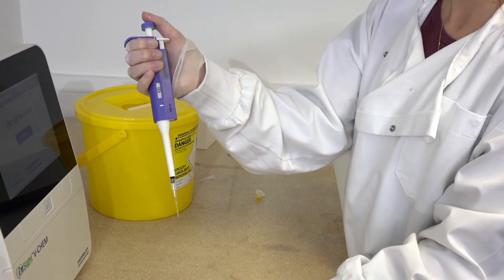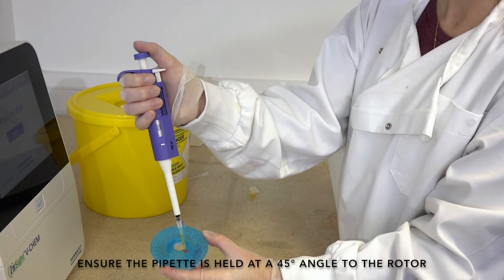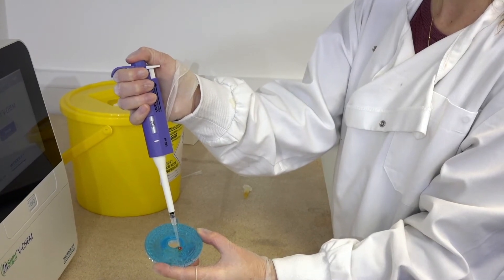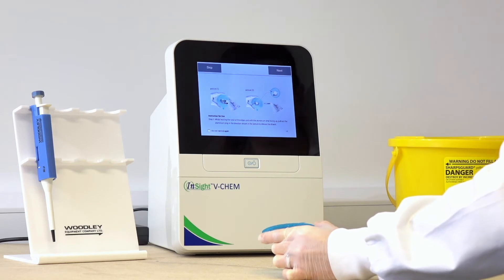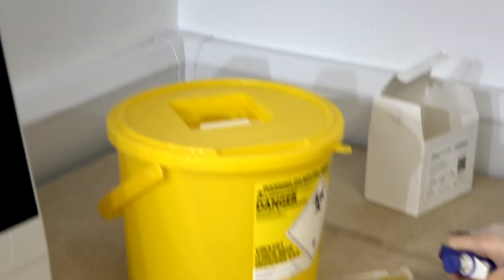Insert the pipette tip into the sample port on the rotor, indicated by a red triangle. Gently push down the plunger at the top of the pipette to the stop position. 100 microlitres of sample will be expelled into the sample chamber. Keep the plunger pressed down as the pipette is removed from the sample port. Discard the used pipette tip from the pipette into a clinical waste bin.